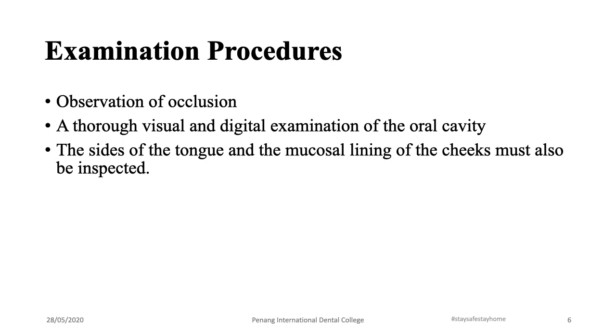Sometimes what happens is there might be a premature contact, that is one of the teeth is coming in contact before they go into maximum intercuspation. So if you see that, that means to say there is a premature contact or there is a retruded contact position, and then it might glide into maximum intercuspation. So this is one of the errors you check before you go into any of the other problems. Once you see that, you will have to rectify this problem.